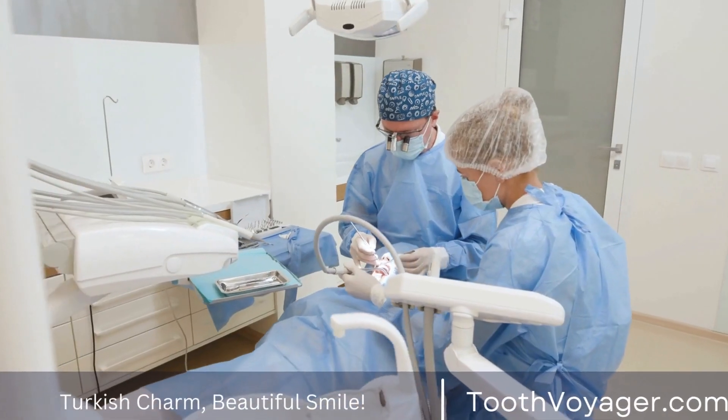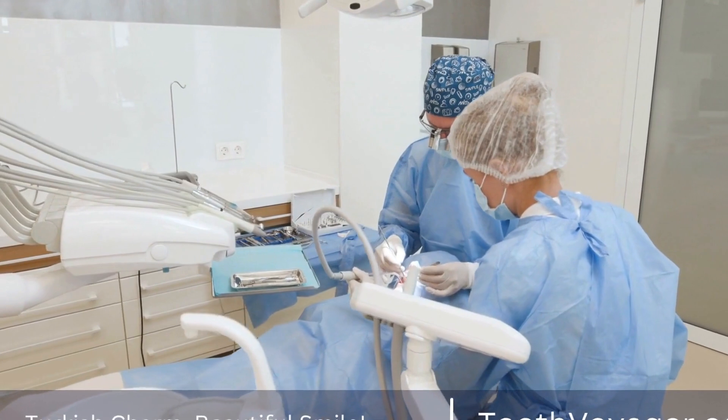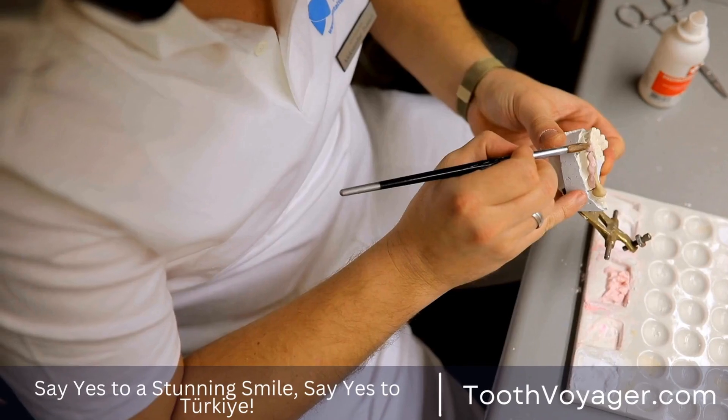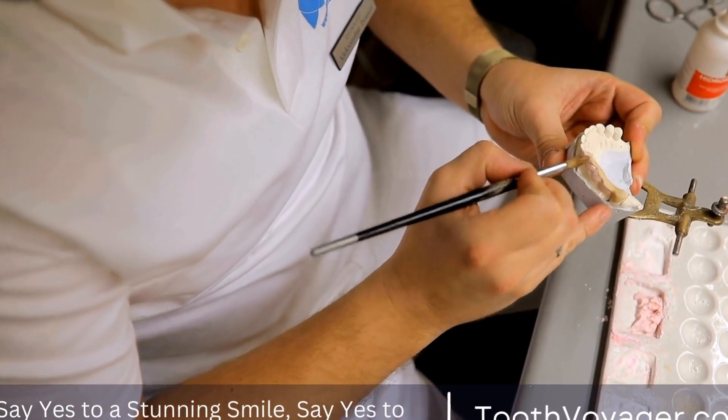Fitting: Once the crown is fabricated, it is fitted onto the prepared tooth to ensure a perfect fit and alignment. Any adjustments may be made at this stage to ensure the crown feels comfortable and functions properly.